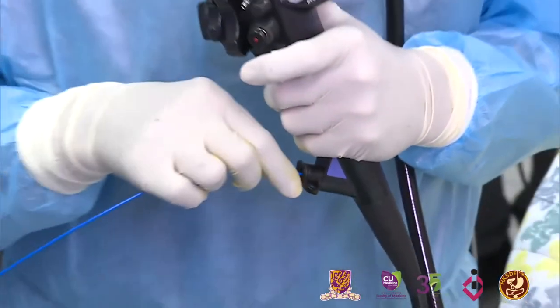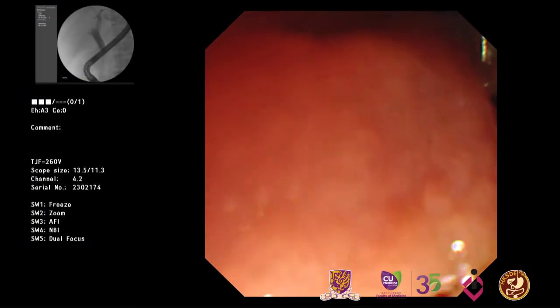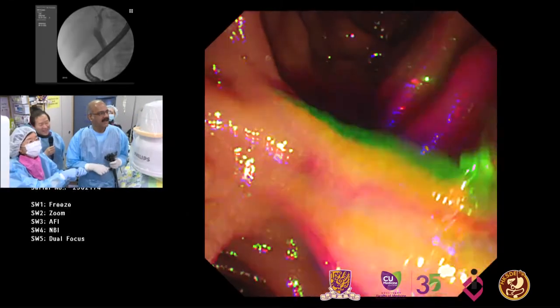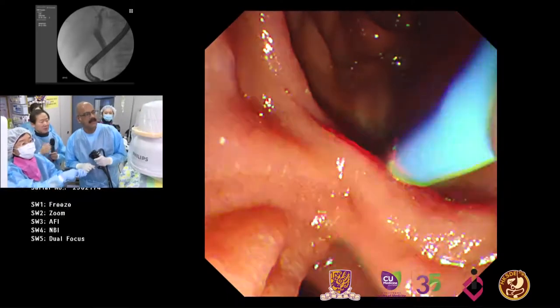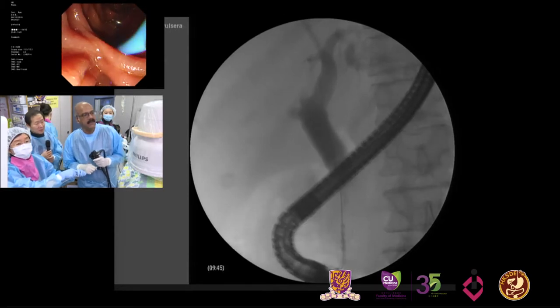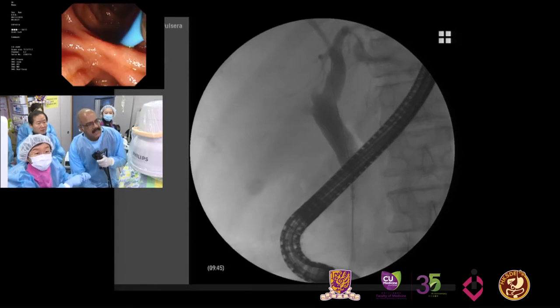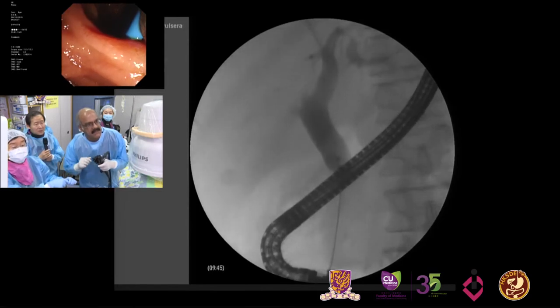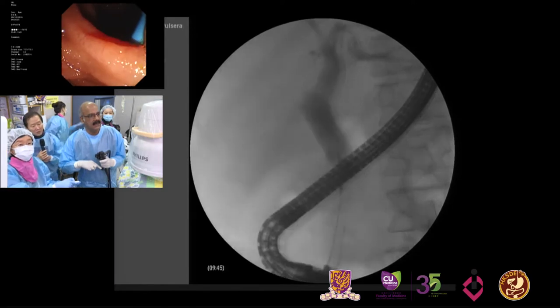Okay, so this is the basic. This is 7 French, so it goes in easily through the channel of the endoscope. And then I'm now going to check on fluoroscopy that my position is okay. So now I'm getting this spin. You can see the electrode coming out endoscopically. You'll also see it coming out on fluoroscopy, if you're getting the fluoroscopy picture there. So what I do is, you can see that on the fluoroscope, the top part is a little covered. So I'm just going to push my scope down. Then you can see that I can see the top part. I'm going to come down a little so that I just put it there, just at the top.